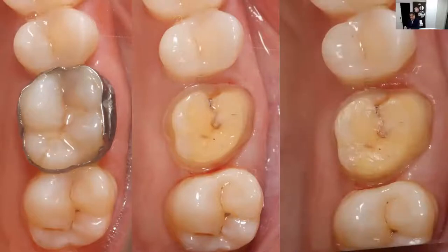But basically, when you really dry this tooth, it's quite obvious that you can see different crack lines. That's not the groove. There's another crack line here. There are so many other crack lines here that it is impossible to tell. You're only looking at one view. Like prior images, you can see that the cracks are at different angles. You may see one part of the crack at one time. It's a full three-dimensional area that one needs to look at.